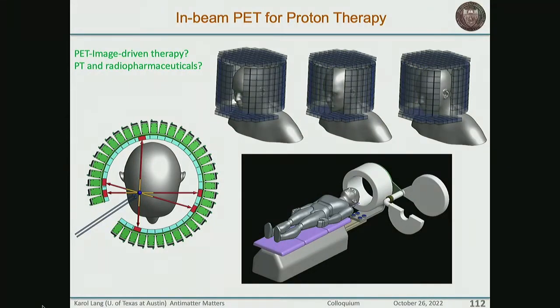You can rotate the cylinder, and depending on where your beam needs to come in, you could come in here or here or here, and you would be getting the tomography from the activation as I discussed earlier. And this is a possible engineering rendering. So this would be yet another white device in a room, but this time perhaps it would be a lot easier to identify what's behind it.